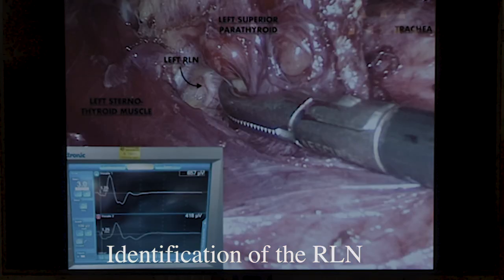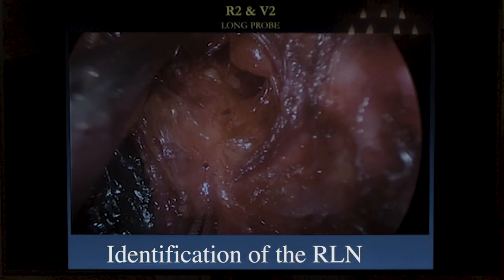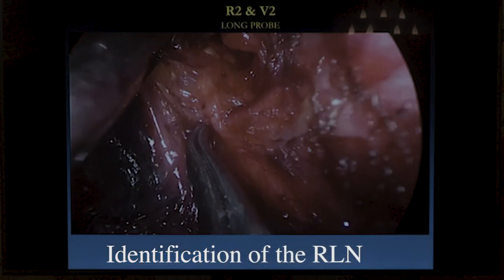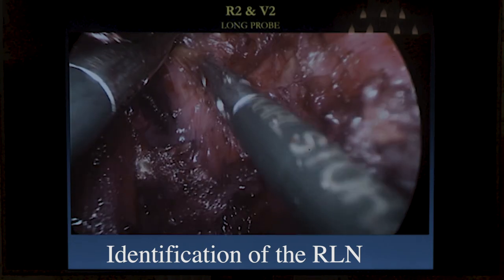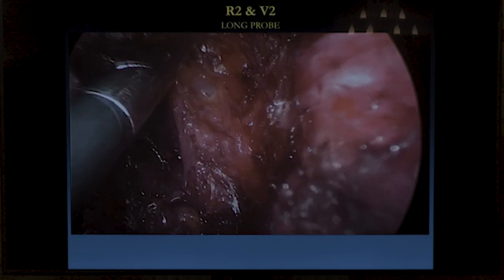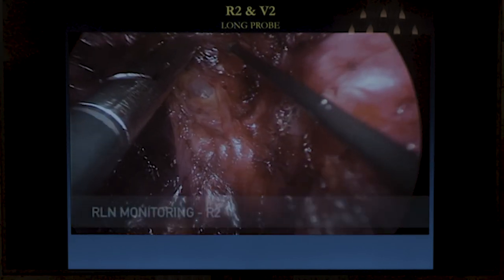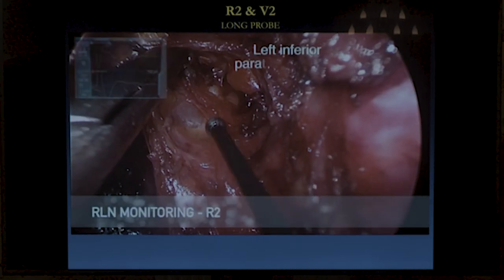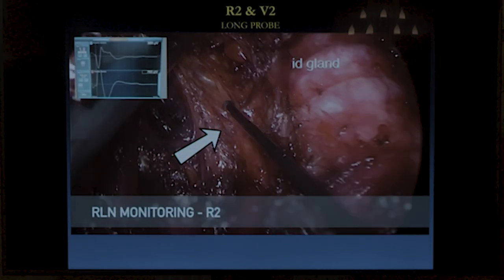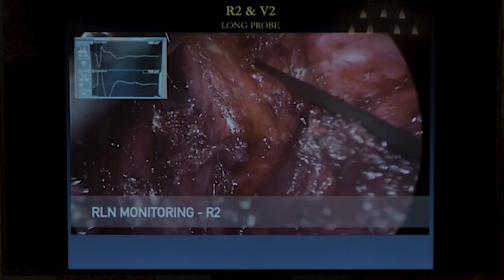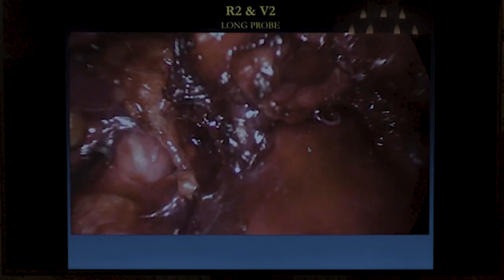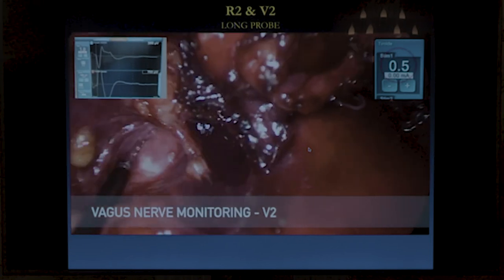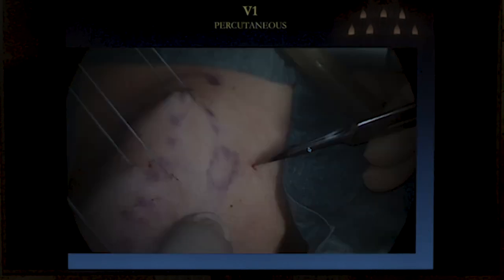Here is the long probe in use. At the end of the surgical procedure on the left side, this is the recurrent nerve. We are bringing in the long probe — it should be at least 30 cm long. We are testing R2, and then we will test the vagal nerve stimulation, the V2 signal.